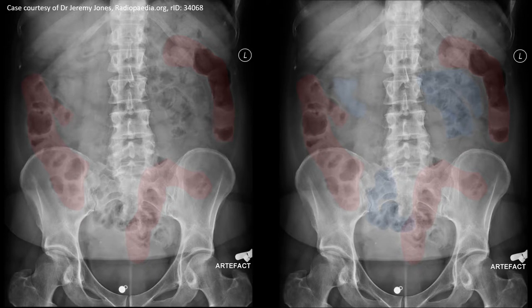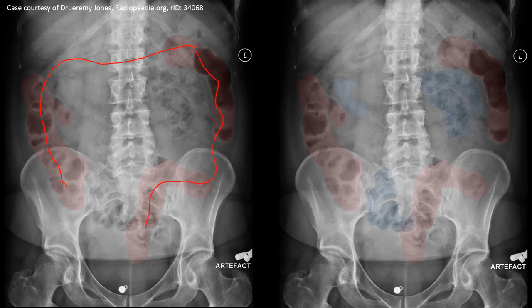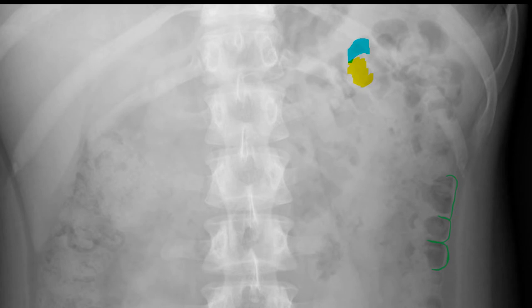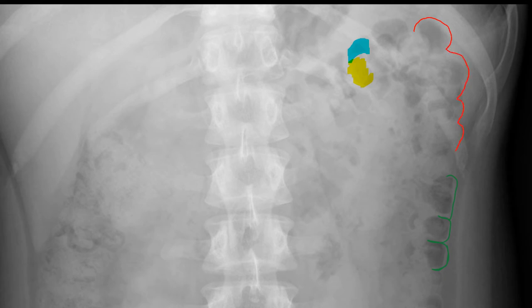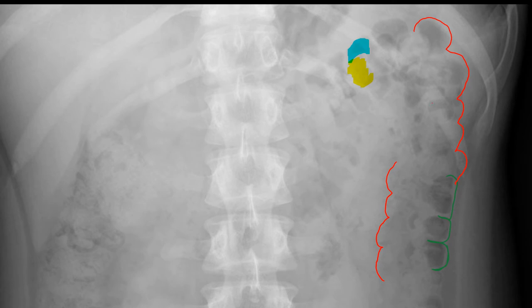In this image, we will try to identify the loops of the small intestine. As you can see, the large intestine covers the peripheral part of the abdominal cavity, and in the central part we can identify the loops of the small intestine. You can see air in the large intestine, and at times air in the small intestine is also visible. This is a focused and enlarged part of the large intestine where we can identify the haustra. The haustra are clearly visible in plain abdominal X-ray. In addition, we can identify this thickened opaque white structure, which is the taenia coli.